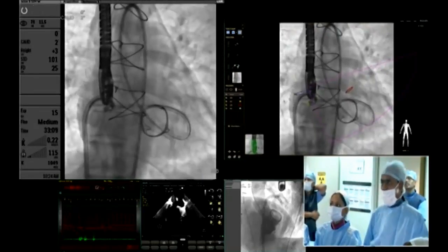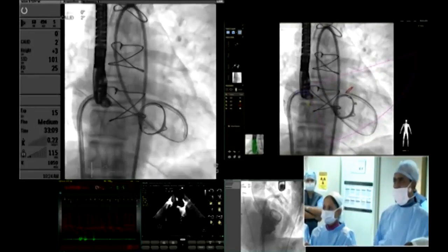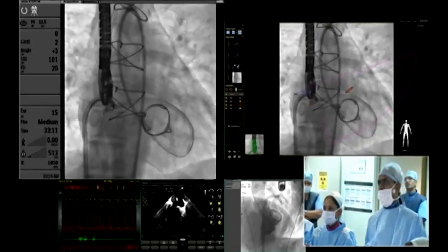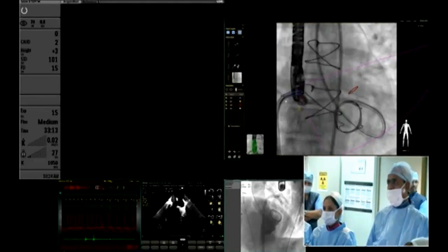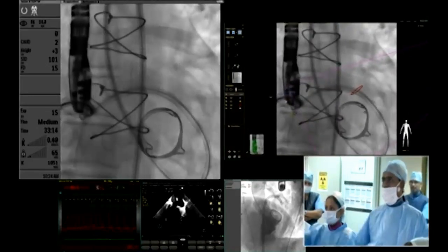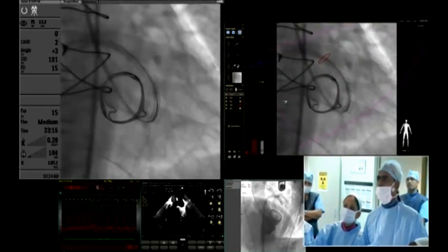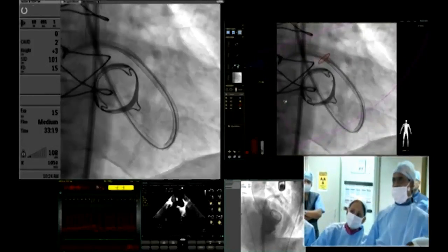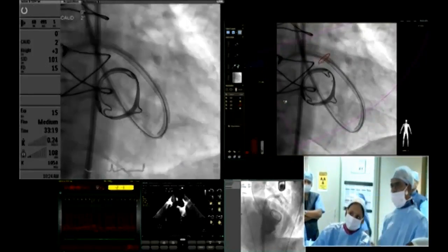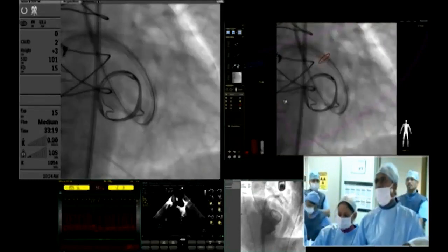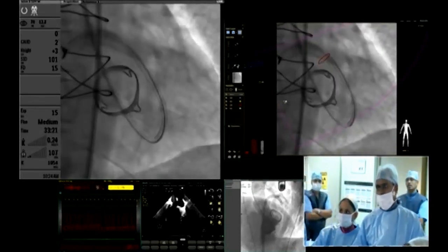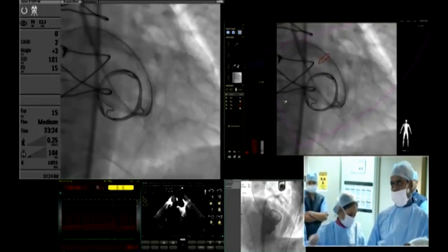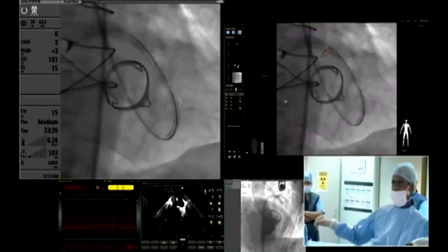We can appreciate that the braiding has actually gone off. Even without magnification you can appreciate this — trying to struggle more might lead to a total fracture of the sheath there. I think we will have to think of something different — take the sheath out. I don't think the sheath is any good for doing the procedure. It looks like it already has a greenstick fracture and it is going to convert to a complete fracture and dislocation. I am going to take the sheath out and advance a guiding catheter.